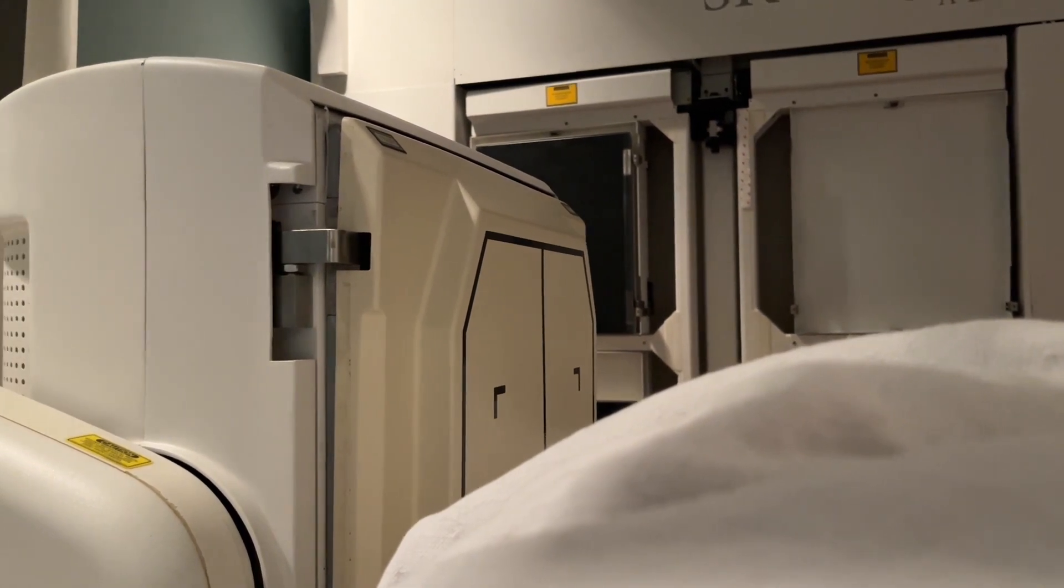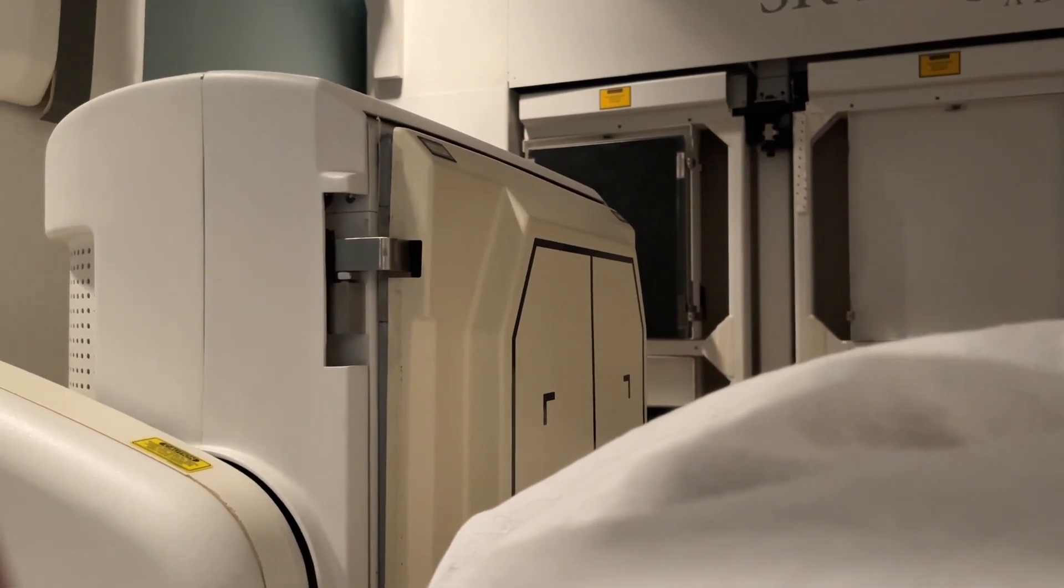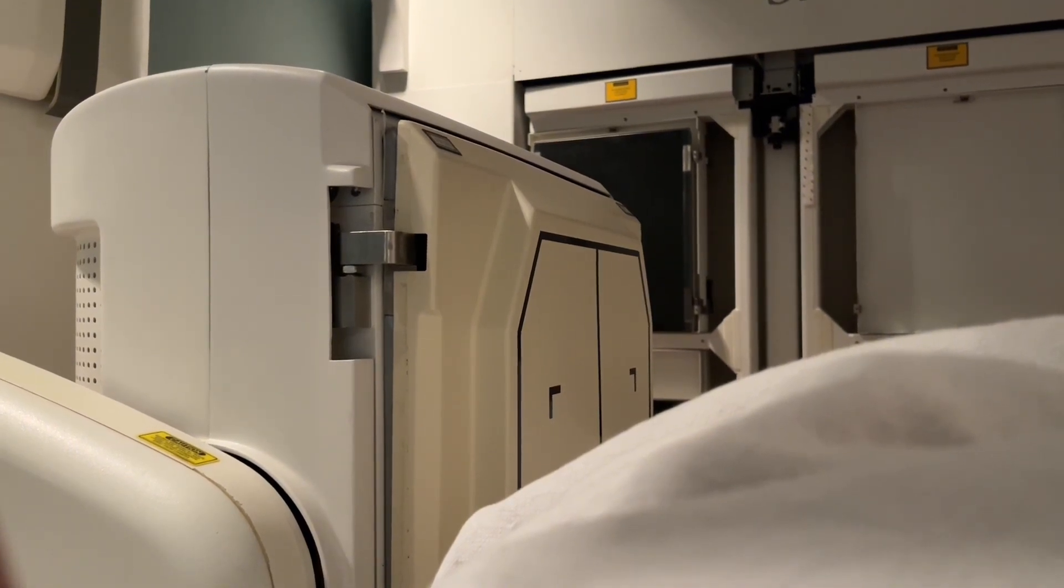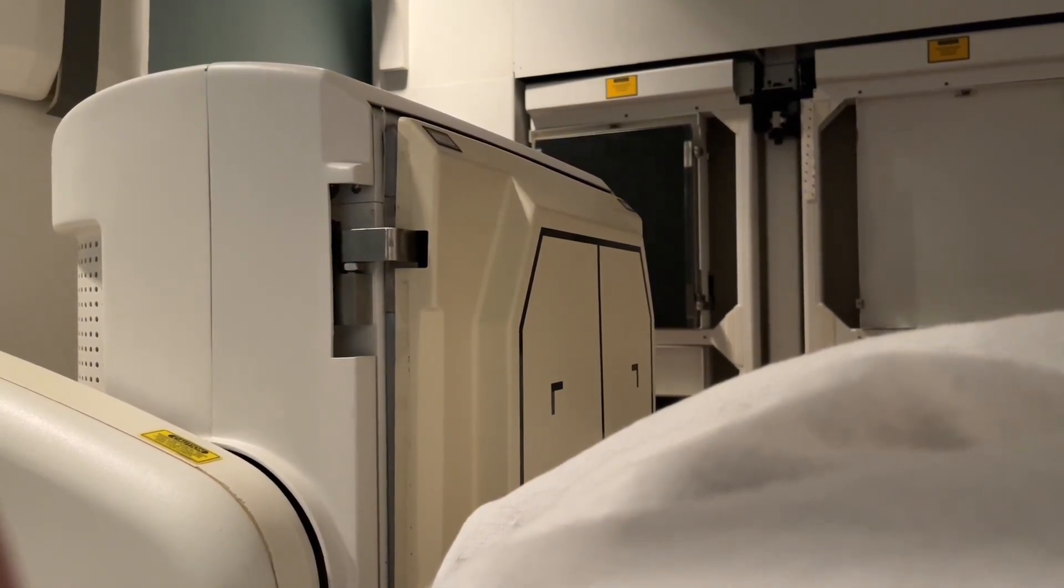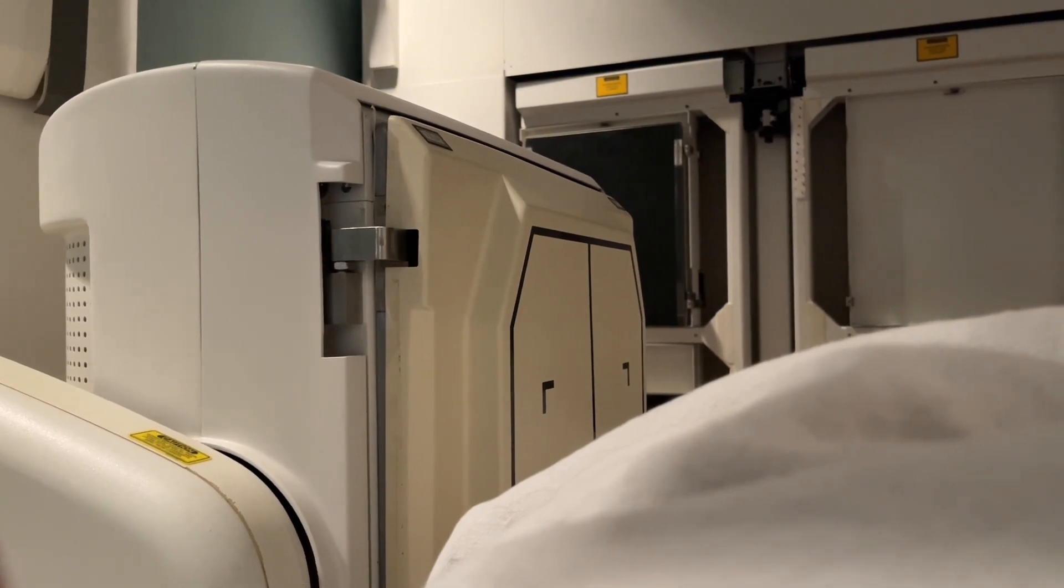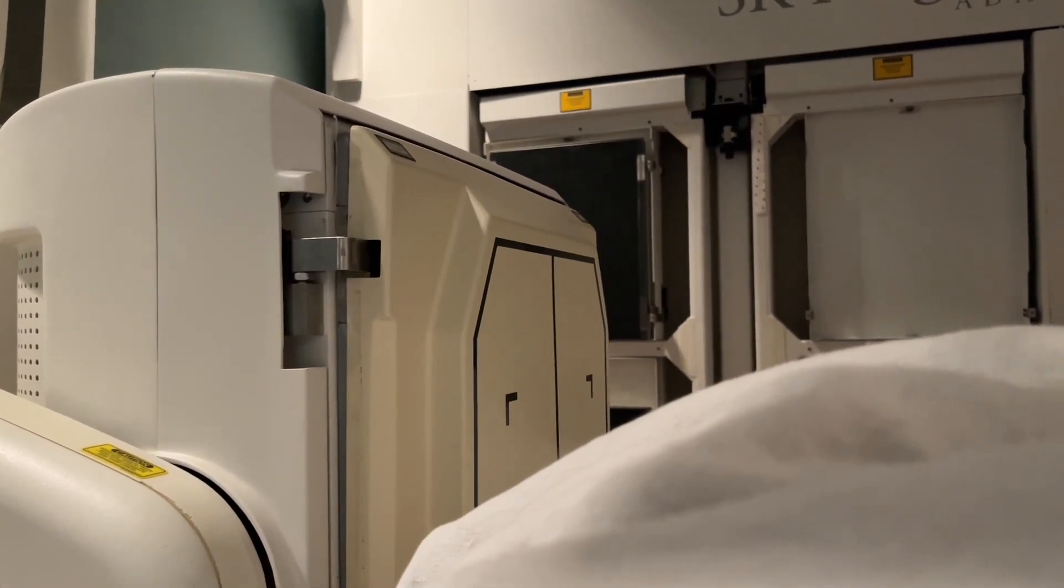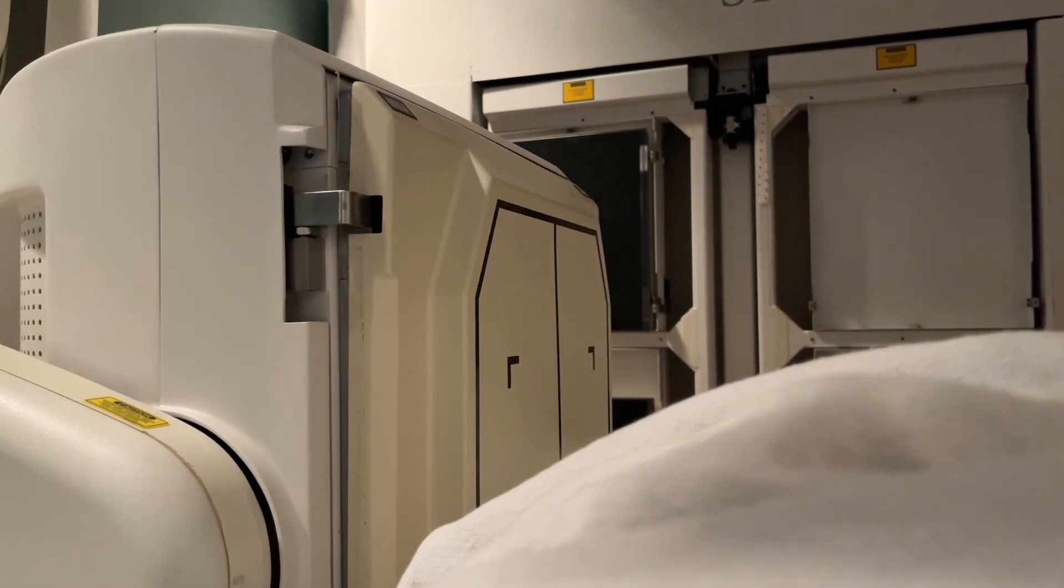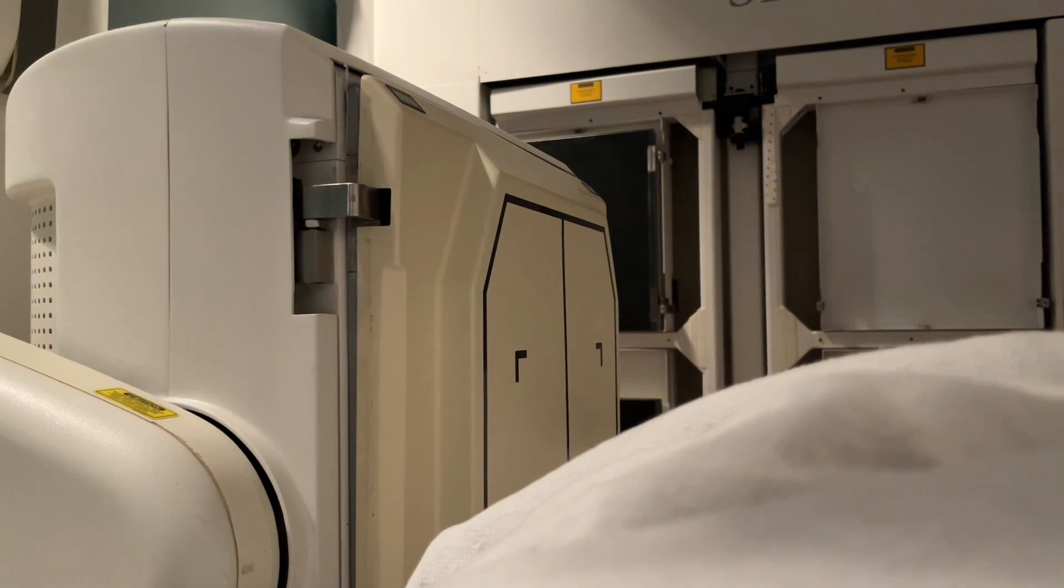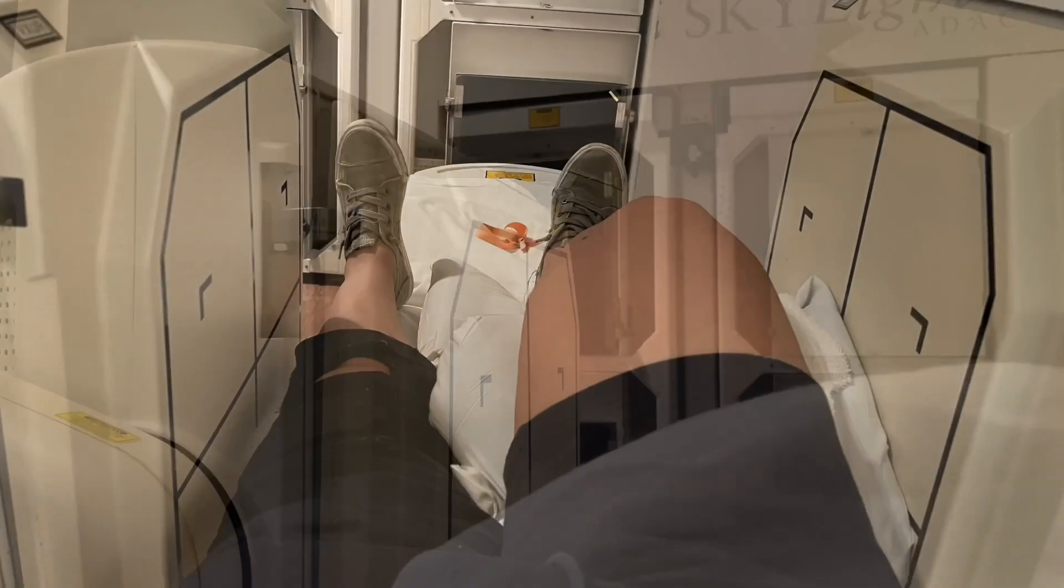The time that I was talking about at the bottom is counting down the set of pictures that they are doing at that time. So this is an angle. See, they gave me a blanket and I, I'm going to show a picture. You'll be able to see when they had my legs separated without the rubber band, you'll be able to see the angle that they put or the position that they put my legs in so they can get the pictures that they wanted. But this machine is huge.